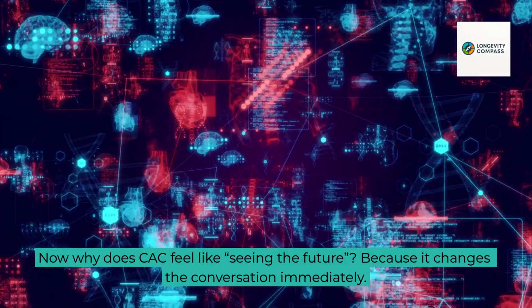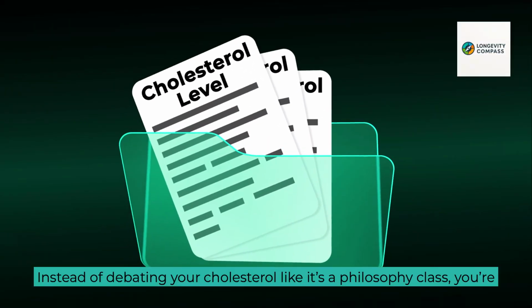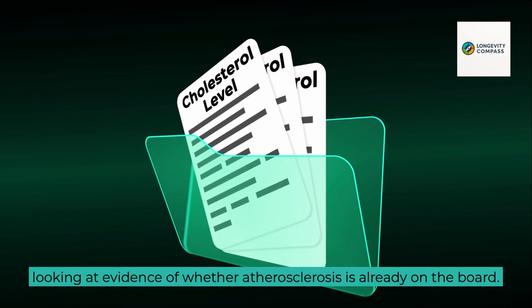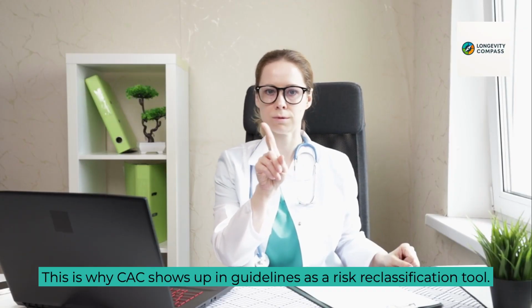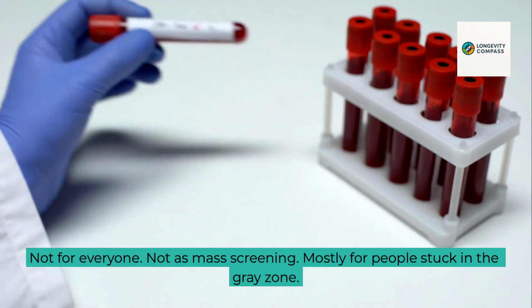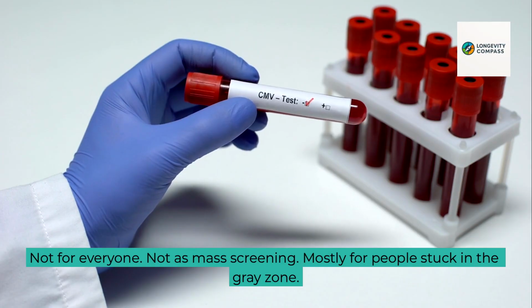Now why does CAC feel like seeing the future? Because it changes the conversation immediately. Instead of debating your cholesterol like it's a philosophy class, you're looking at evidence of whether atherosclerosis is already on the board. This is why CAC shows up in guidelines as a risk reclassification tool. Not for everyone, not as mass screening, mostly for people stuck in the gray zone.